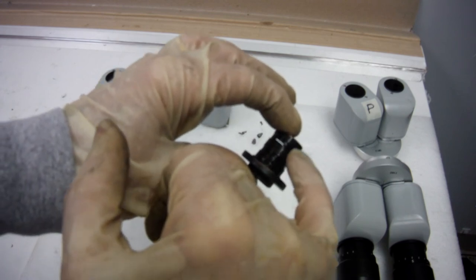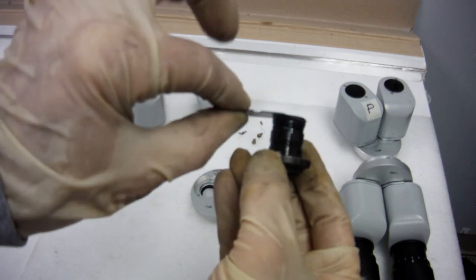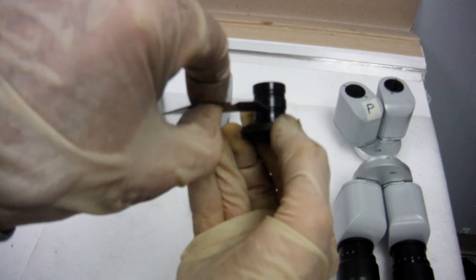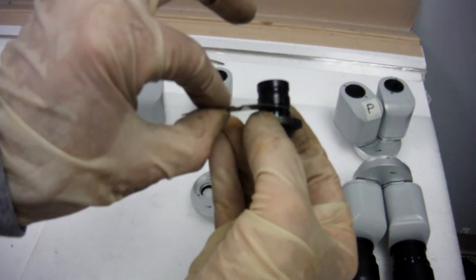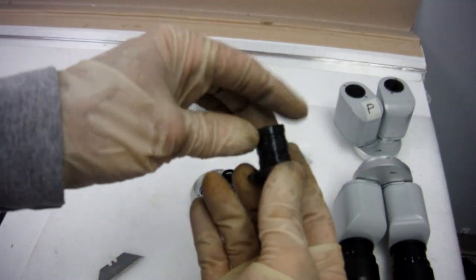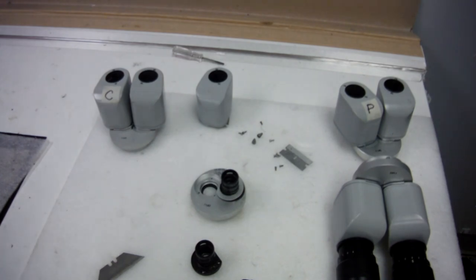If one of your eyes is out, it's probably because that's a little bent. You can try to open the edges up if they've collapsed. They're not the same, but they should be even all the way across. You turn and you can see the gap on one side. On the inner edge is different than what's in the middle. That means it's probably got pulled and collapsed. So if it's possible to open up that edge a little bit, your alignment will be better. But you get it the best you can, and if you can't get it, then you try to align it with the methods I showed you earlier. Give it a try.